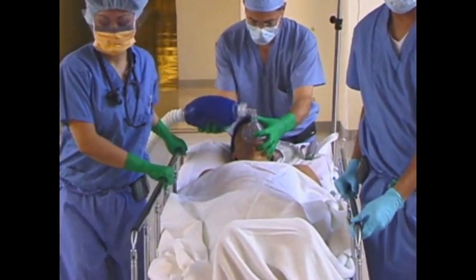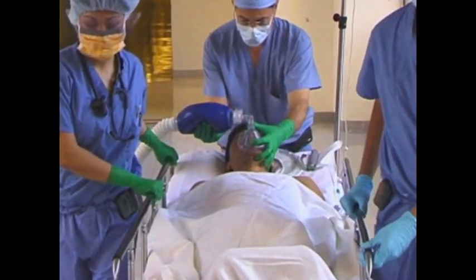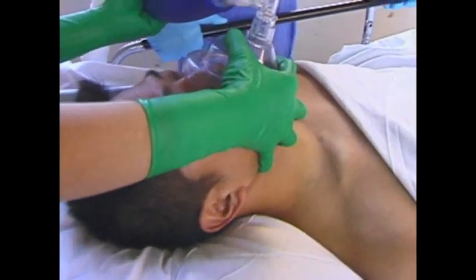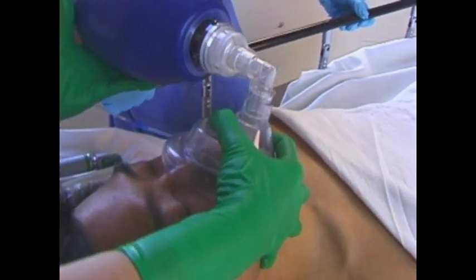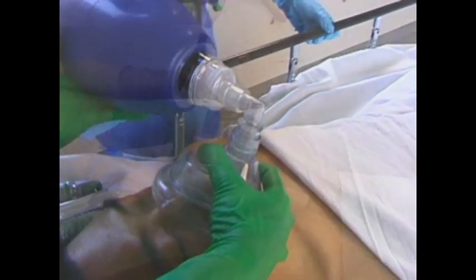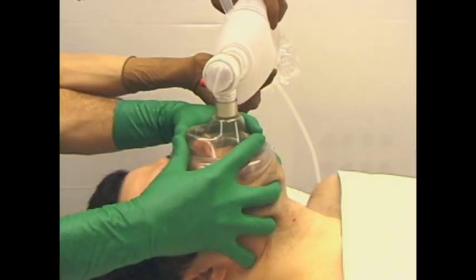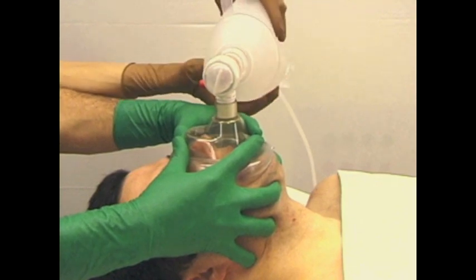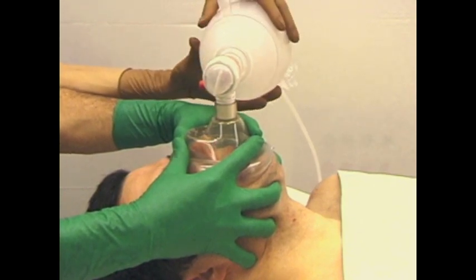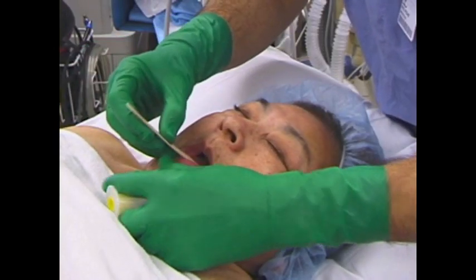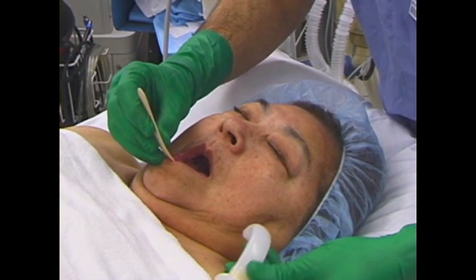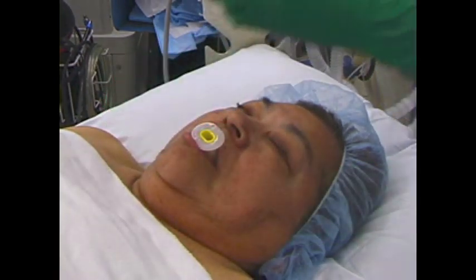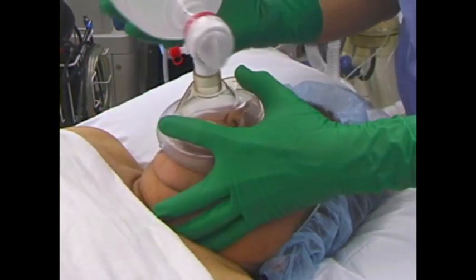Providing positive pressure ventilation with a face mask and a bag valve device can be a life-saving maneuver. Although seemingly simple, the technique requires an understanding of the airway anatomy, the equipment, and the indications. Developing manual skills is necessary to provide adequate face mask ventilation.